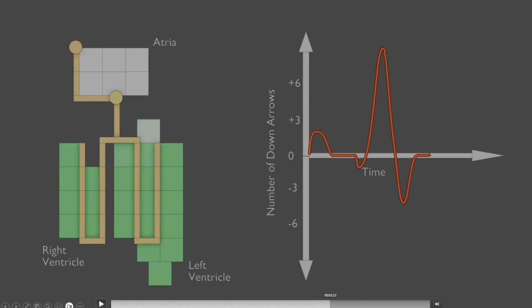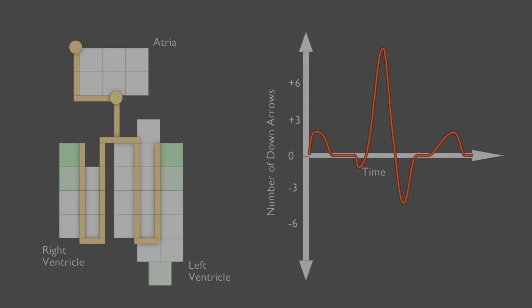That gives us another brief flat period, and then a final wave happens. So we've got nothing moving, and then that repolarization wave moves over the heart. So I've made a choice to not put any arrows on this because you actually need a much more complex model to arrive at the appropriate shape for this final repolarization wave. We really need a 3-dimensional model, and we'll get there at some point.